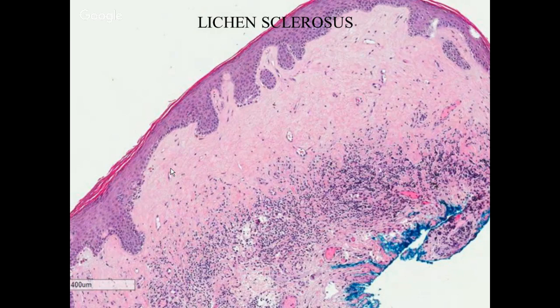But once you see this under the microscope, it is very easy to recognize, and this is another common condition that patients present with. So this is one thing that you should also know. So I'm just giving you, like if you go into the chapter of lichenoid dermatitis, there might be 15 different conditions actually. But what are the bread and butter stuff that you're going to see in routine practice, which you should know as a pathologist, not as a dermatopathologist, but at least as a pathologist actually.